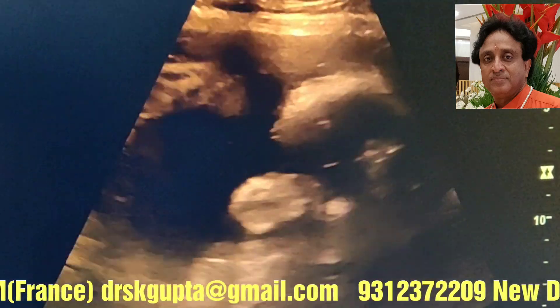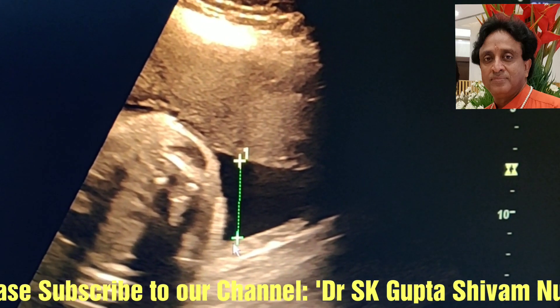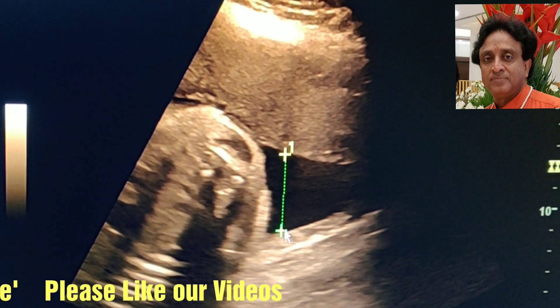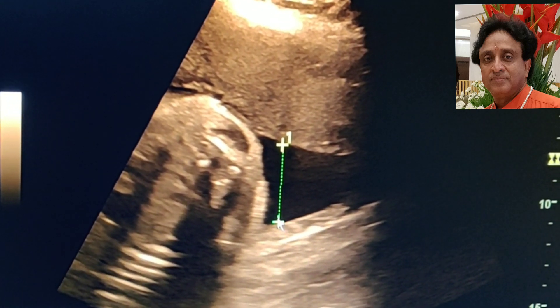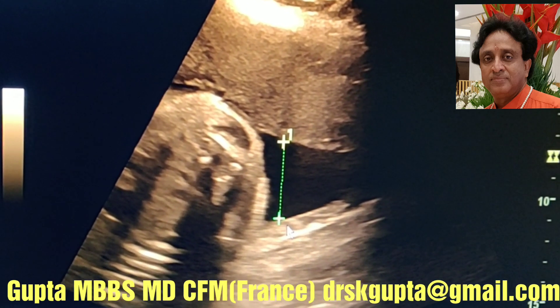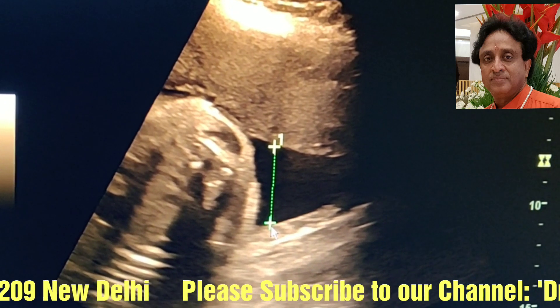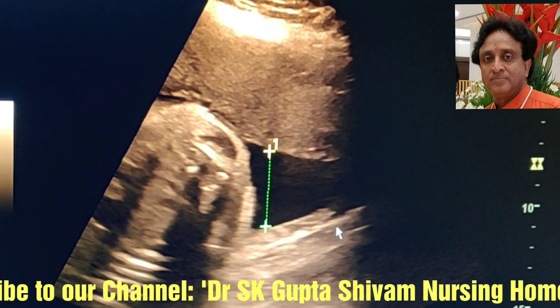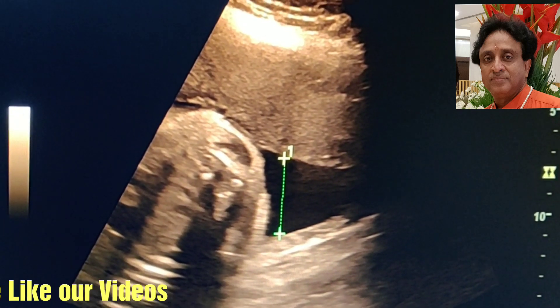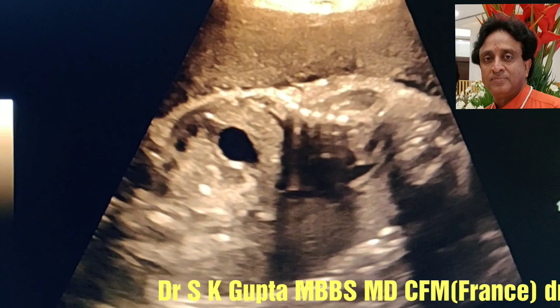The last parameter is the AFI measurement. If in one segment the maximum depth of fluid is more than 2 centimeters, a score of 2 is given. If across all four quadrants the fluid depth is less than 2 cm or the total AFI is less than 6, the baby is given a score of 0. Combined with all these parameters, you can calculate the total Manning score and report it accordingly.